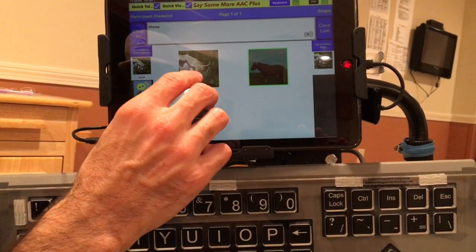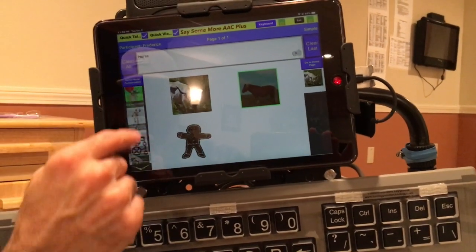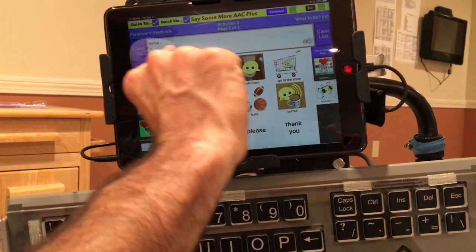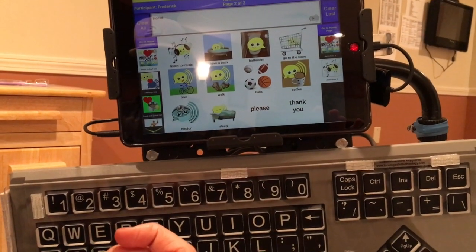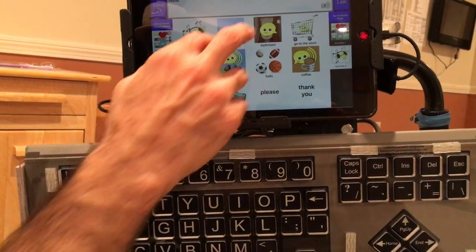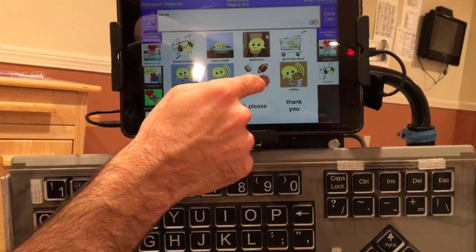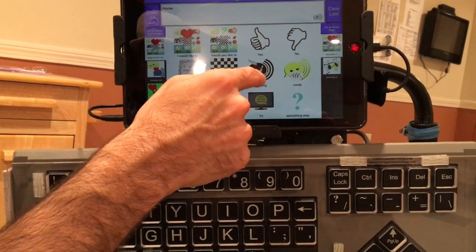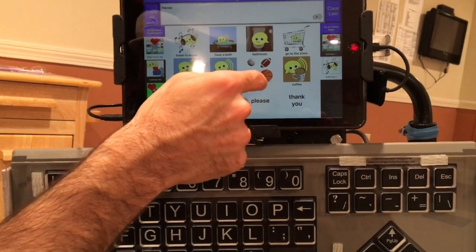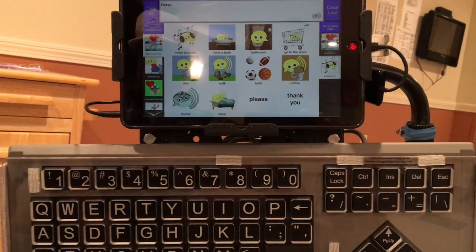If you wanted to do something more advanced and actually swap different icons and different pages, let's say we're back to square one, and we want the bowling to be on page 2 instead of on page 1, and we just want to swap them. I haven't figured out a good way to do that yet, unfortunately. The only way I found out to do it is to completely redo the entire thing. So you can go in and do it manually. If I want to swap bowling for balls, then I edit page 1 and manually change bowling to balls, and then I go to page 2 and manually change balls to bowling by retyping it all in. I can't find a way to swap it yet, but that will be a future update, I'm hoping.